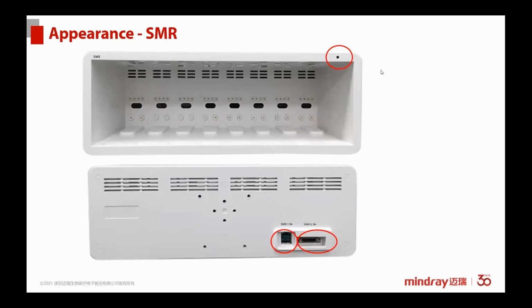In the back view, there are 2 different connectors on the SMR module. The left one is for our old generation high-end patient monitor called the T-series. And the right one is for the N-series patient monitor. So the SMR module rack can be compatible with both T-series and N-series.